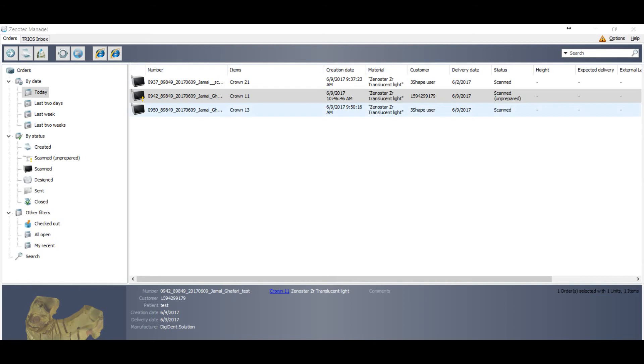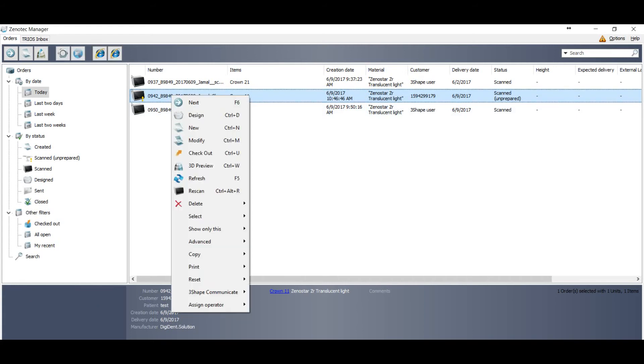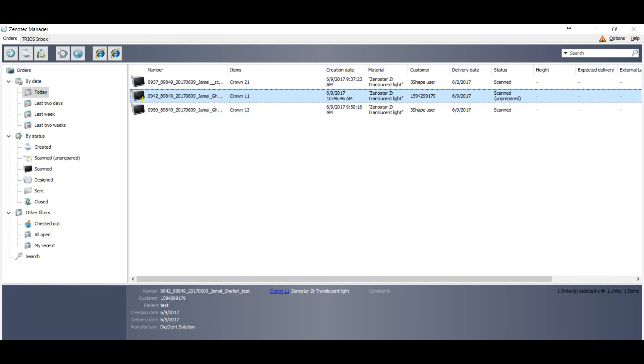Now let's go to the order with the yellow mark. You can convert this type of order if you don't have option opened from DCM to STL on your dongle. So just make right click on the order and go to the design.